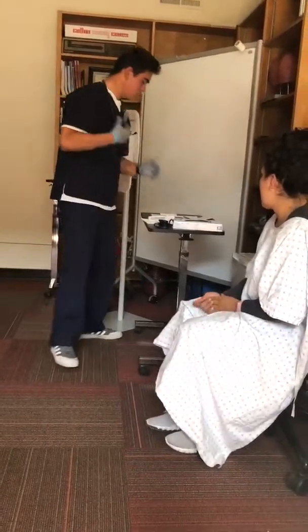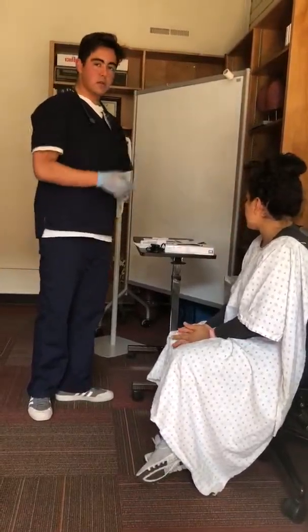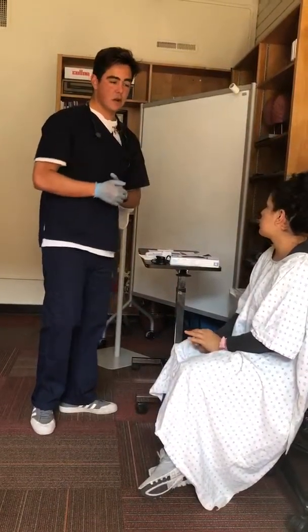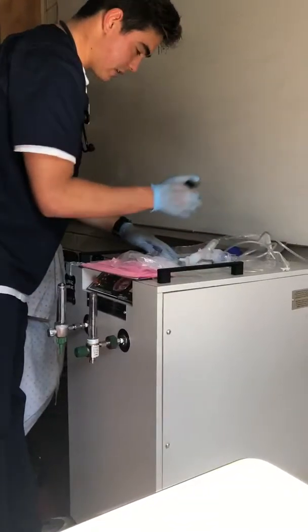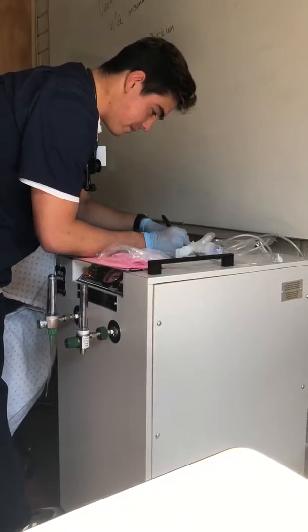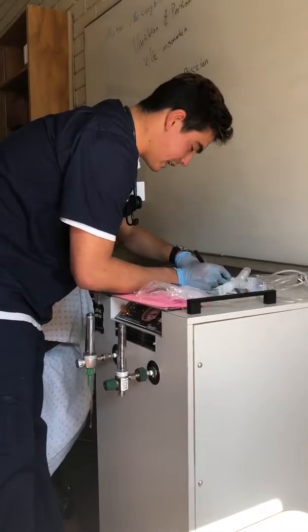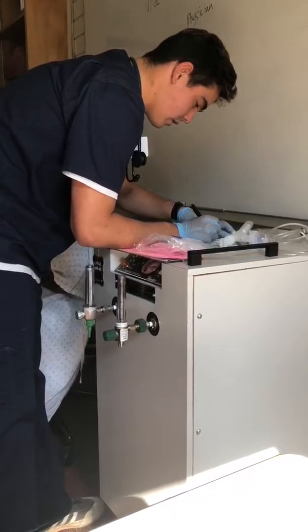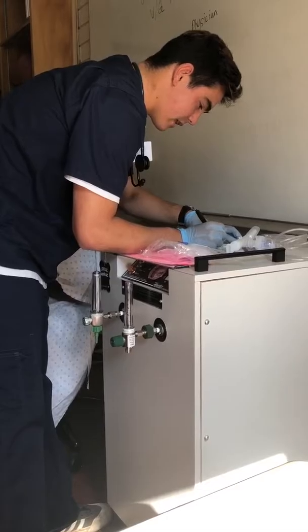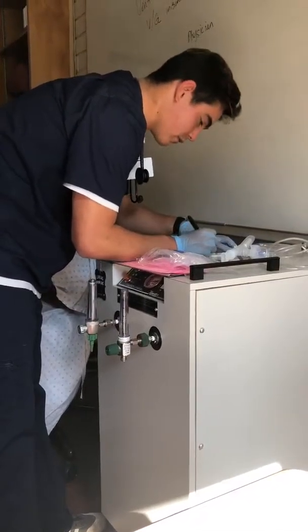Okay. Good job. And you're still feeling good? None of those side effects that we were talking about? No. Okay. So after this, we're going to go ahead and follow up with the patient. We're going to go ahead and rinse their medication for them, their SVN. We're going to note on the patient's bag, so we have something to place it in when we're done, the patient's name, the date opened, that is also set up, that is also on our SVN. We're going to put 11/6, and then the date recommended to be changed, which will be November 13th, unless it's visibly dirty before that.